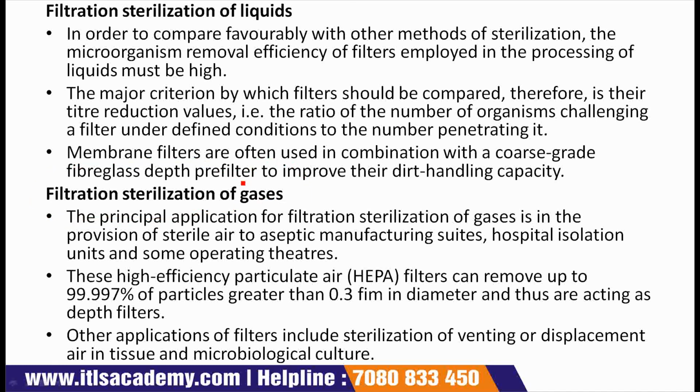So for the gases, very first point is the principal application for filtration sterilization of gases is in the provision of sterile air to aseptic manufacturing suites, hospital isolation units, and some operating theaters.